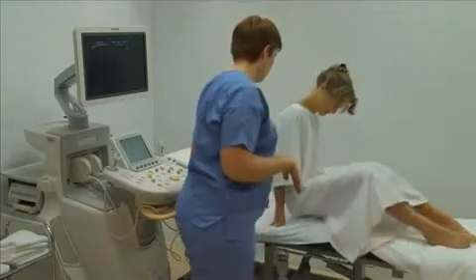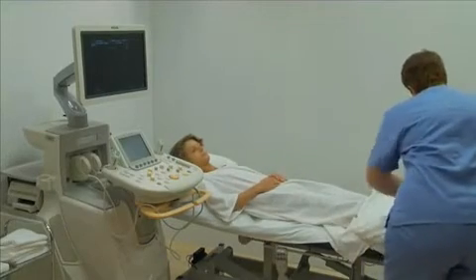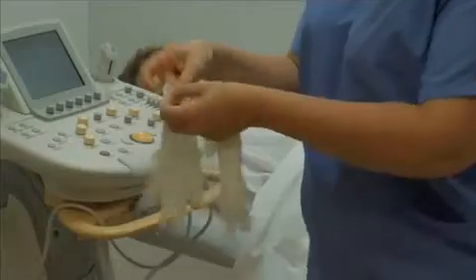Ask the patient to lie supine on the examination table and make them comfortable with the use of pillows or wedges positioned as required. Put on gloves.